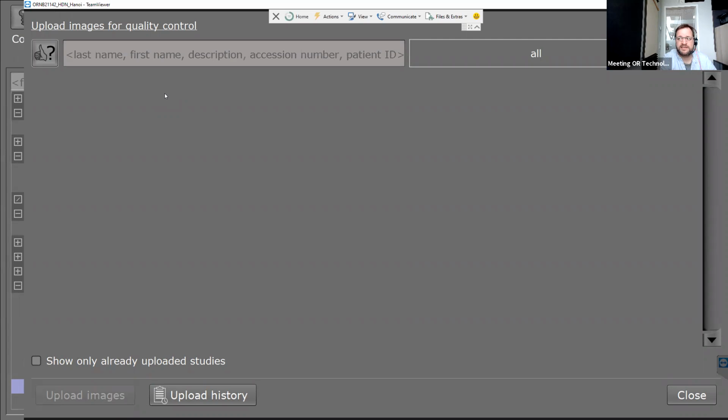So you can send us the sample images, you can send us a small description. Okay, the customer needs more contrast and less sharp, and we can give you also hints how to adjust the images.